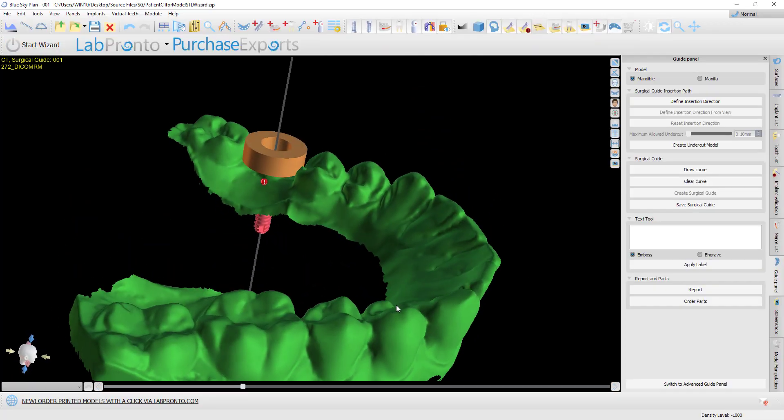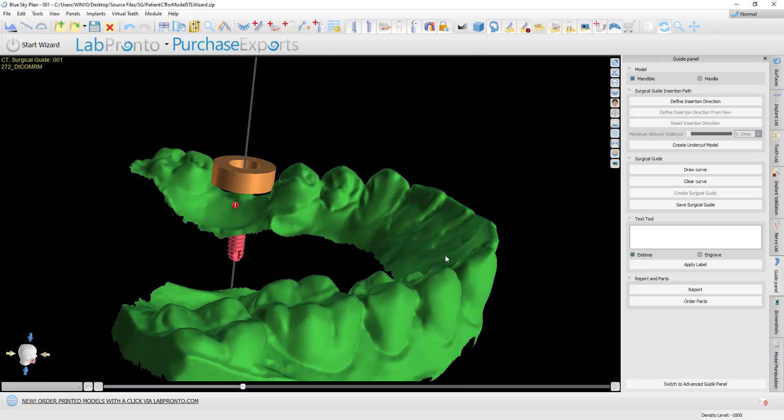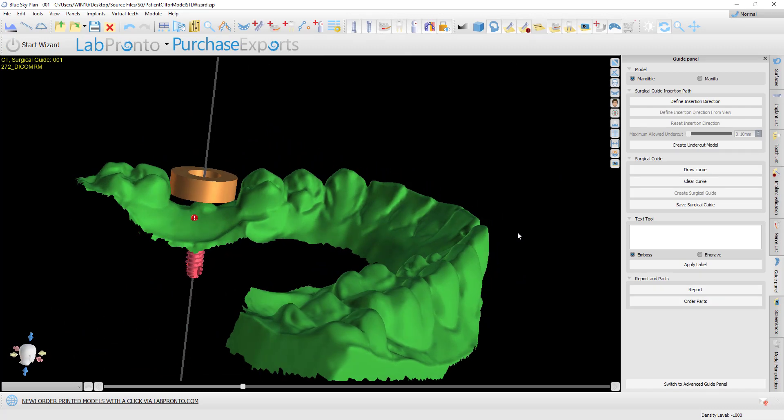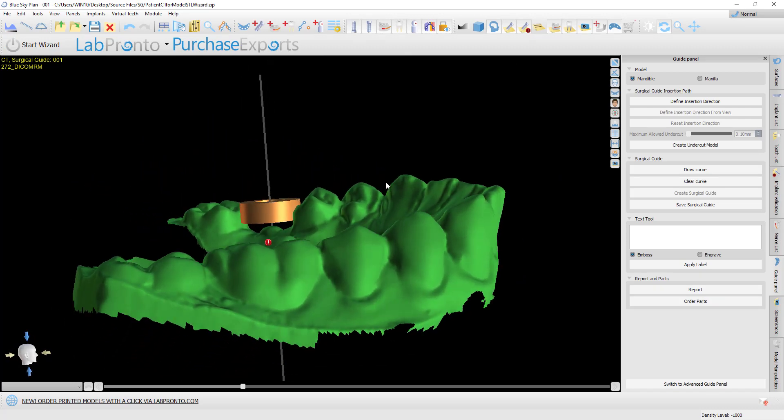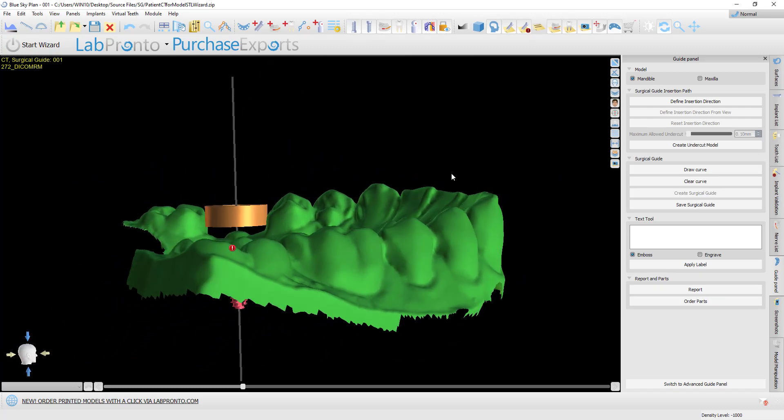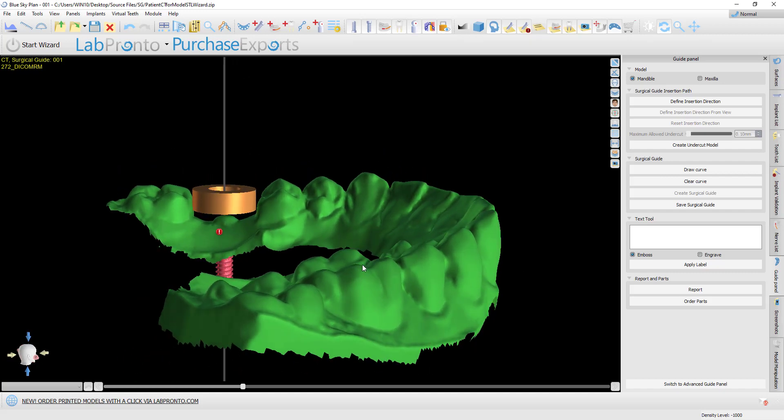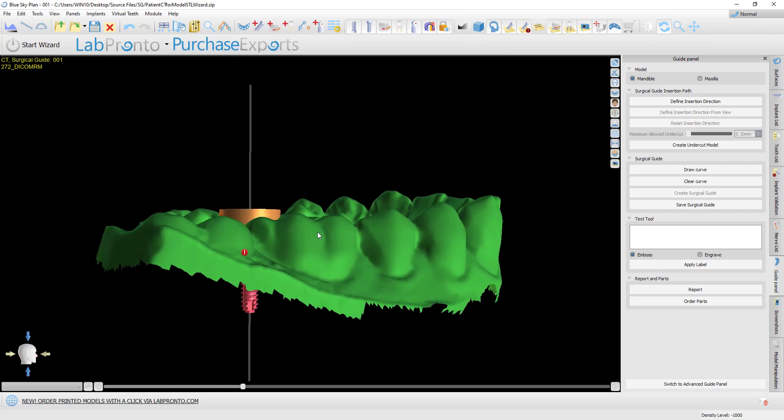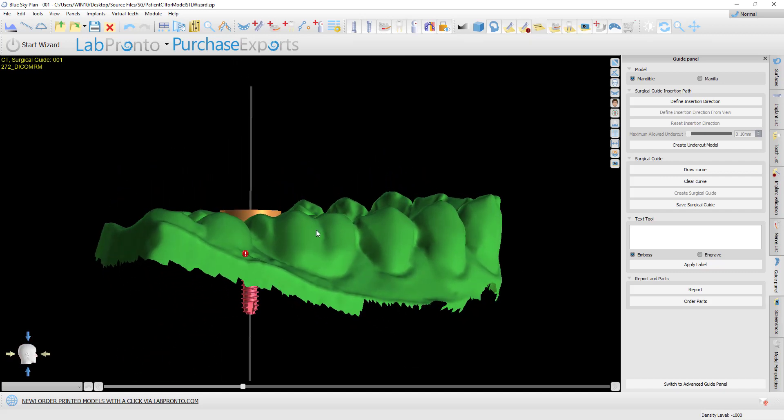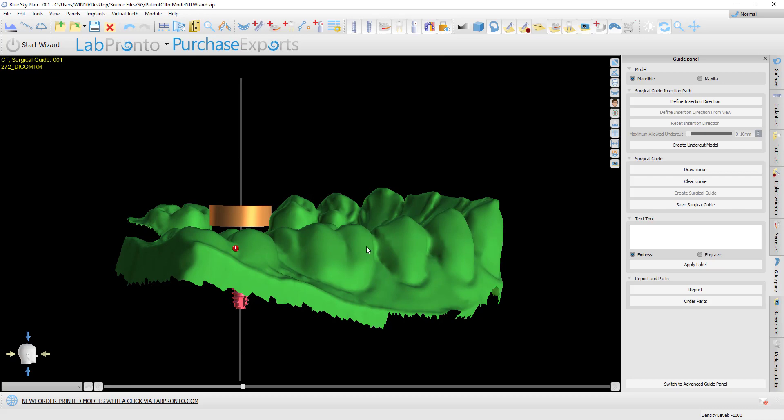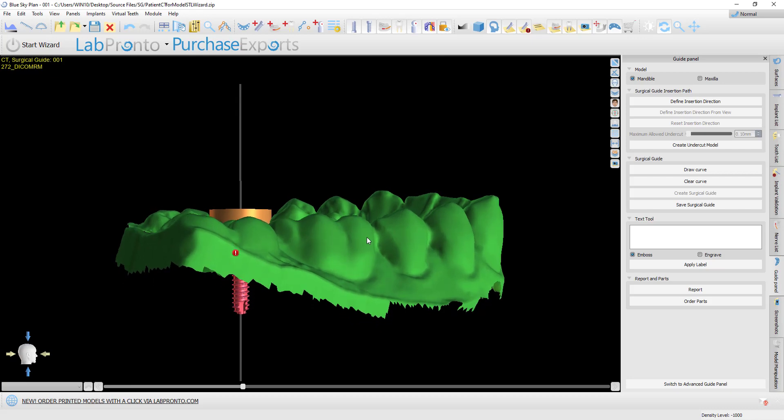In the surgical guide advanced settings, if we don't define a path of insertion, undercuts will be removed at the same 30-degree angle automatically. The user can change that path of insertion by clicking define insertion direction.